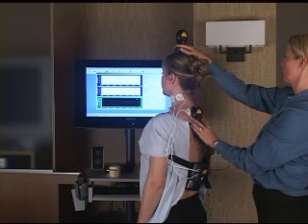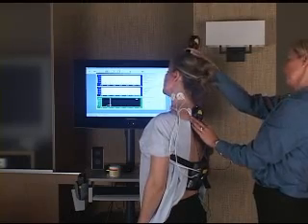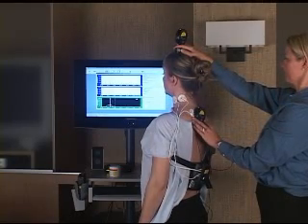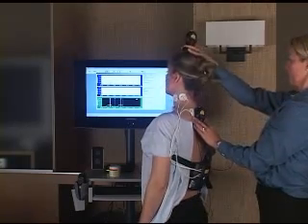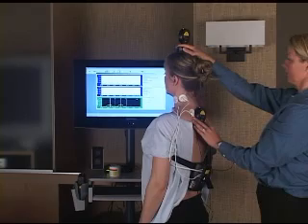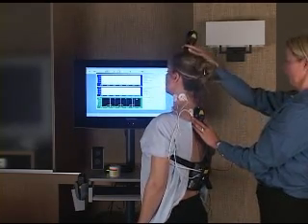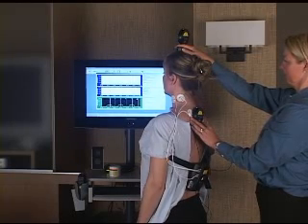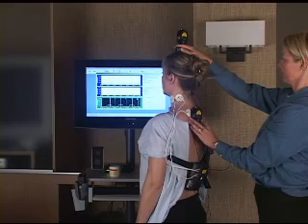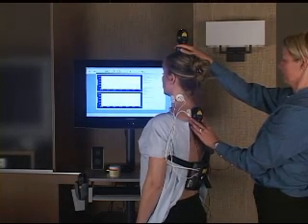Now what we're going to do is press the button again to begin a test to move to the right. So you press and release the button, go to the right, mark it at peak, press the button again at neutral, press and release, back to neutral, press, move to the right, press and release the button, back to neutral, press and release the button, and you're done. If you want to move on to the next level, you press and hold the button and it'll take you to the next screen.